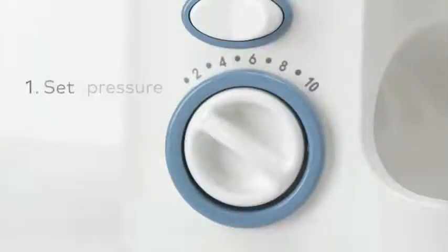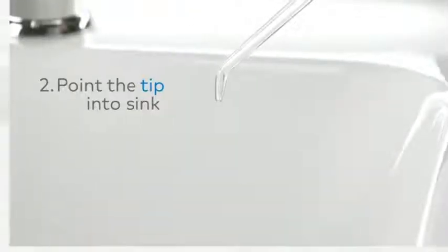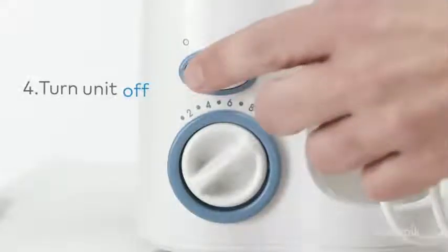Number 1. Set the pressure control to high. Number 2. Point the tip into the sink. Number 3. Turn on until water flows. Number 4. Turn unit off.